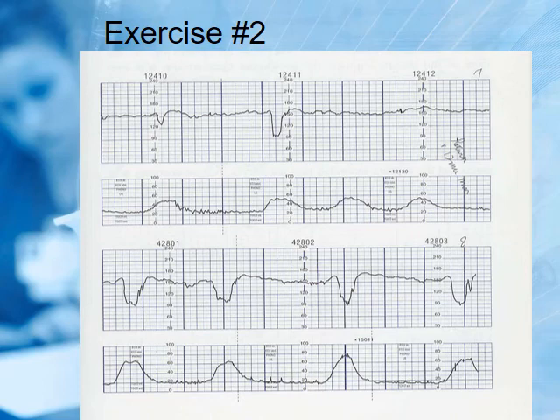It's another exercise in evaluating the pattern and the tracing. So I'm going to have you first talk about the contractions, write down on a piece of paper how often they're occurring and how long they're lasting.